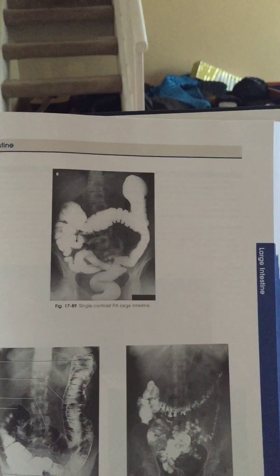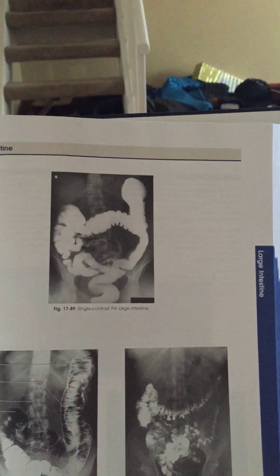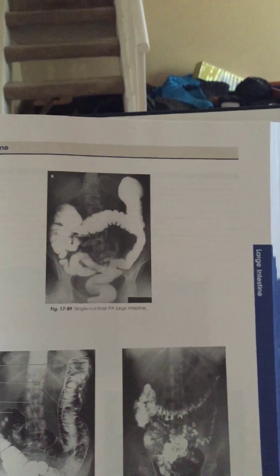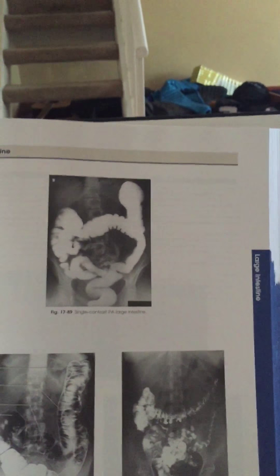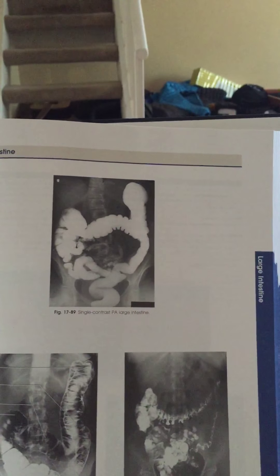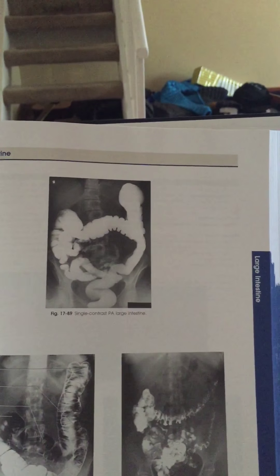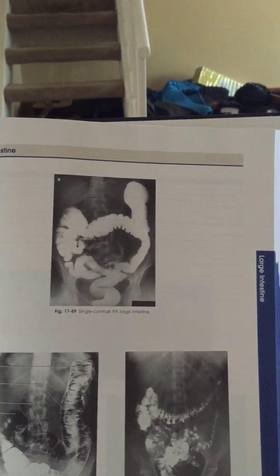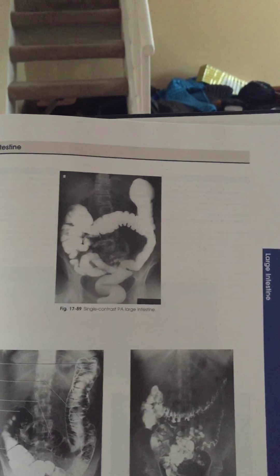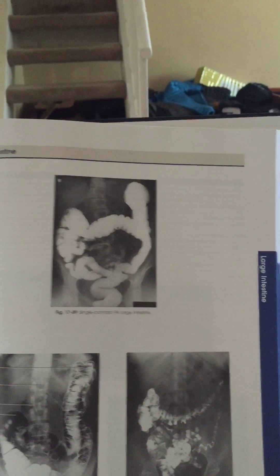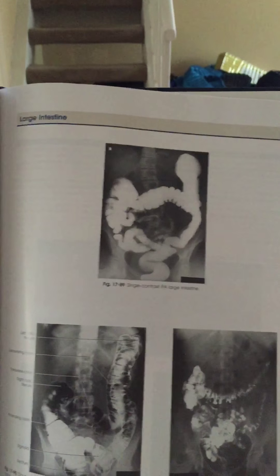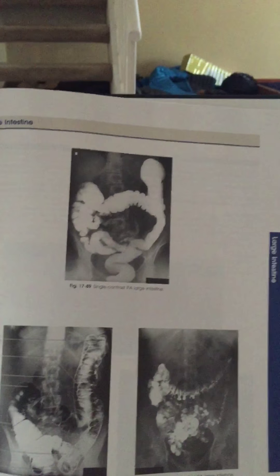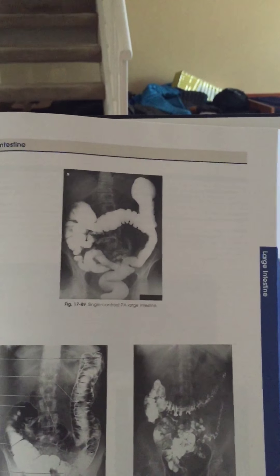In my BE trigger it was a PA projection. What you're looking for is evidence of proper collimation, the entire colon including flexures and the rectum. You want the vertebral column centered so that the ascending and descending portions of the colon are included, and an exposure technique that shows all the anatomy.